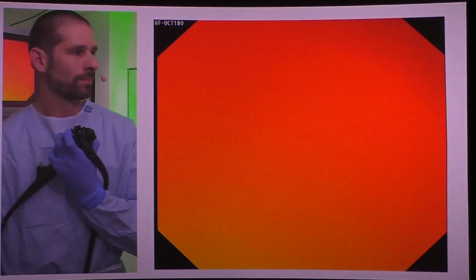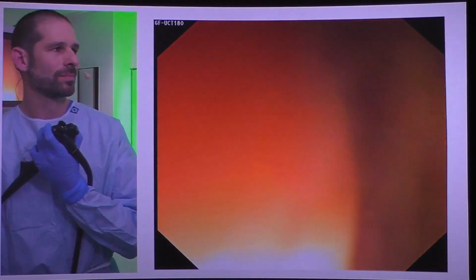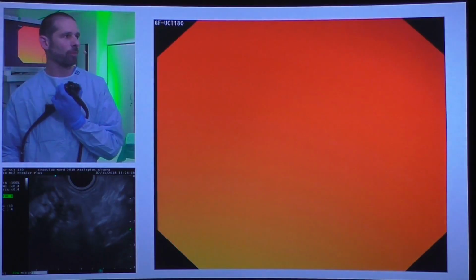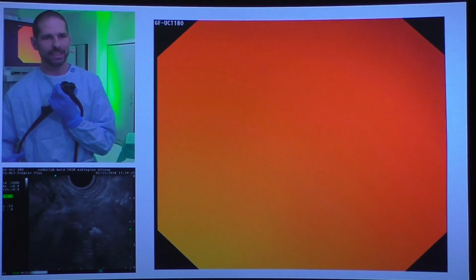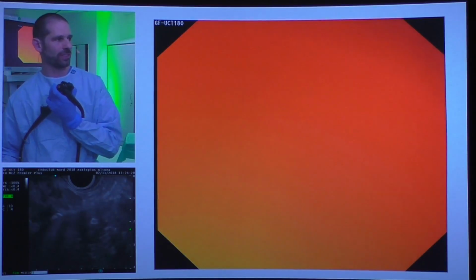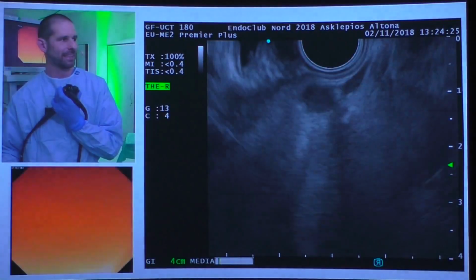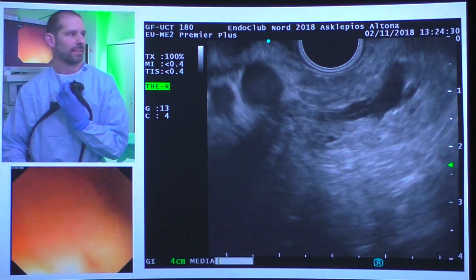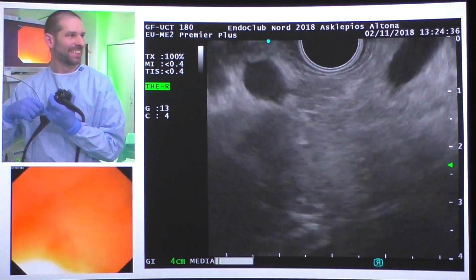Well, do you have to puncture this finding if you saw the changes? And there is a fish mouth papilla. The main duct IPMN diagnosis is secured, and this is also securing the indication for surgery. Well, what's solid here is that these are nodules that are not classic nodules, and we carried out a very good MR, and in the MR we didn't see anything, only dilated lateral ducts. Now, I didn't want to distract you. Please puncture. Are we better than the MR?